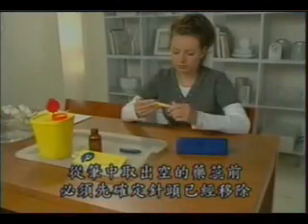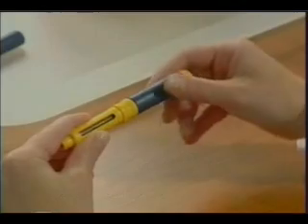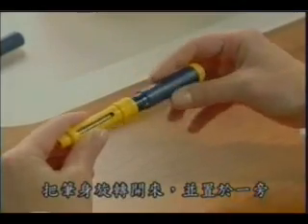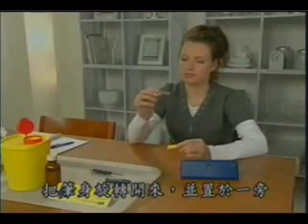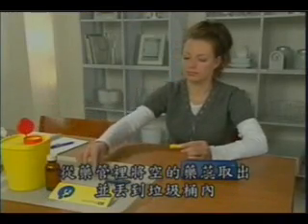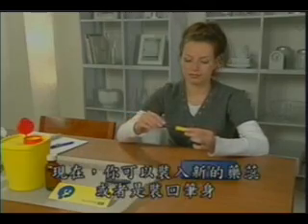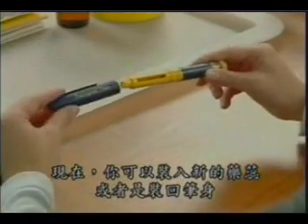Before removing the empty cartridge from the pen, the needle must always be removed. Unscrew the body of the pen. Put down the body and remove the empty Puregon cartridge from the cartridge holder and place it in the sharps disposable bin. You can now either prepare the pen for loading the next cartridge or reassemble the Puregon pen.